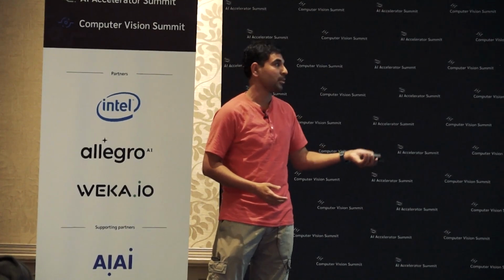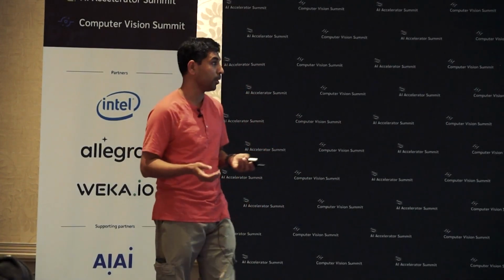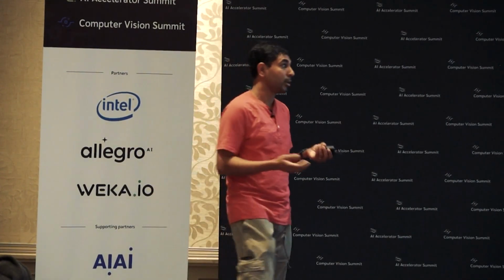And again, this is a classic example of so many papers published on this. Everybody claimed, oh, with 80% accuracy, we can determine what step of the procedure is being performed. But why is it not out there? It's not out there because it does not generalize, right? And it's not going to unless we have the scale and the diversity in data.